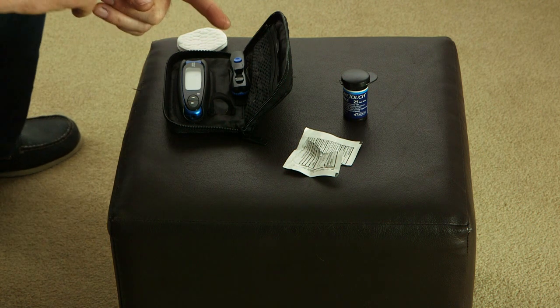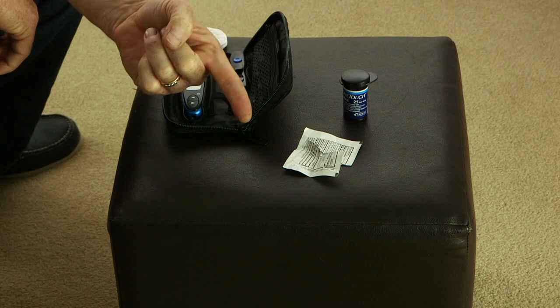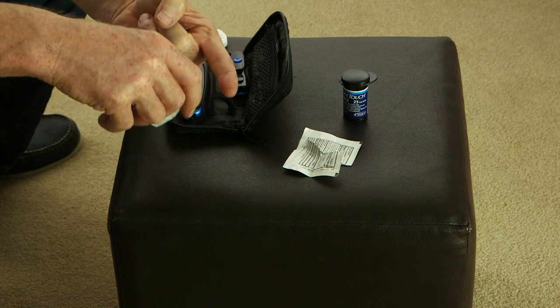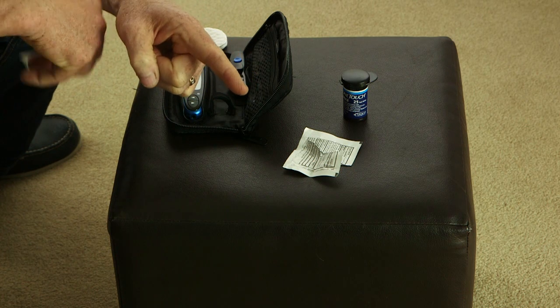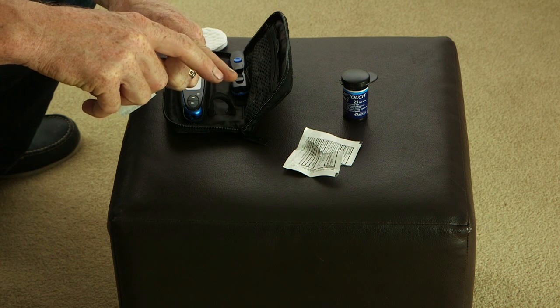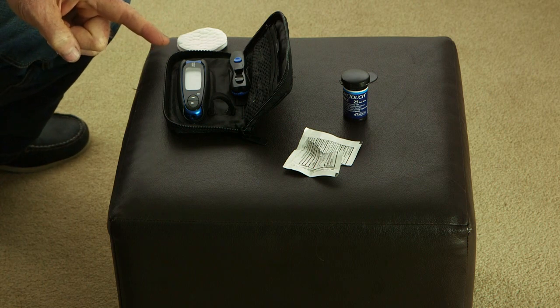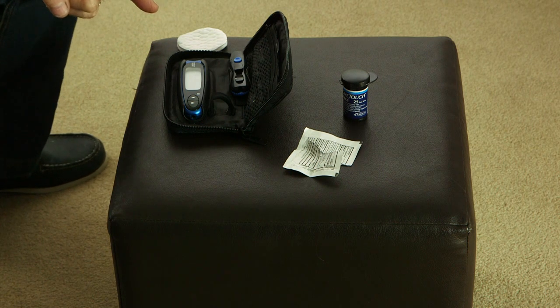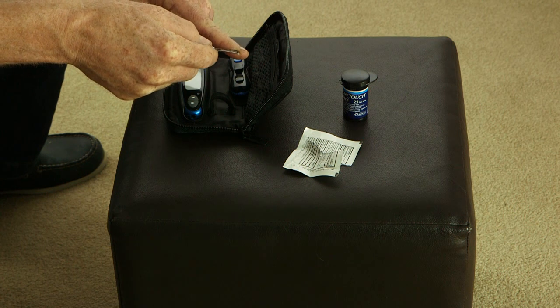Now, you'll often see people use the pad of the finger. You know, it sure does work. It's pretty common. There's also a lot of nerve endings there. You'll feel that more than you will most anywhere else. The side of the finger, not right by the nail, but right on the edge to where it's still a little bit soft. Let me grab a pointer here. That'll work for a pointer. So right about there is a great spot.